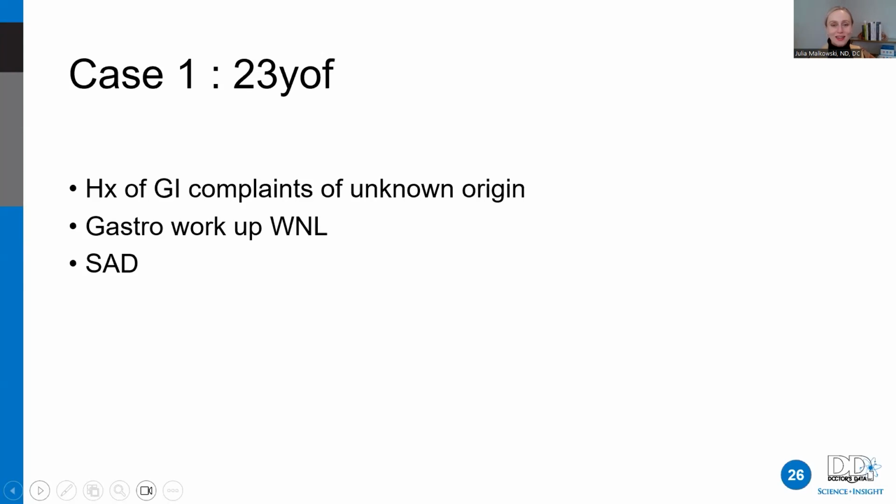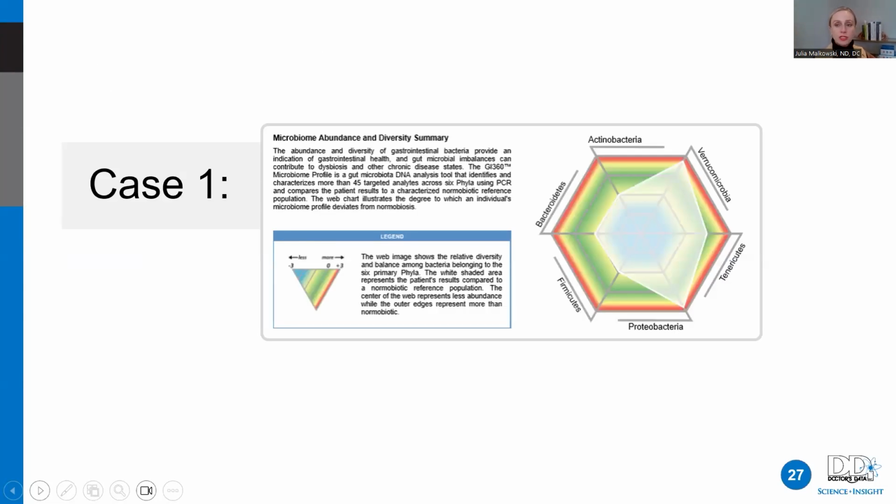I know you all are in Canada, but you are probably dealing with some individuals on the standard American diet as well. And we know that that is associated with adverse health outcomes. So let's take a look at the web. I want to start here because this is the first place to look. Remember, this is your patient's result organized by phyla: the actinobacteria, verrucomicrobia, tenericutes, proteobacteria, firmicutes, and bacteroidetes. And this is your patient's result, the white web superimposed on the normal biotic reference range, which is that green hexagon there.